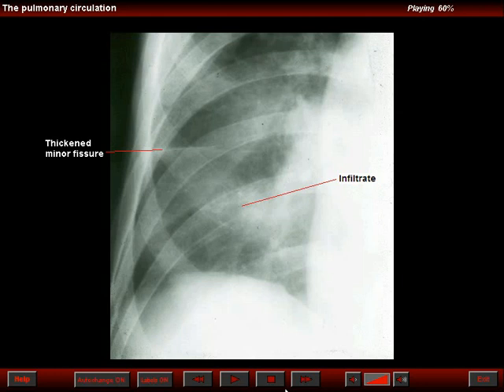A regular pneumonitis is less likely as a diagnosis because pneumonitis generally does not reduce the lung volumes, and a focal pneumonitis often is not associated with tachypnea. So once again, tachypnea out of proportion to parenchymal changes or the lack of parenchymal changes, one should always suspect the possibility of pulmonary thromboembolism.